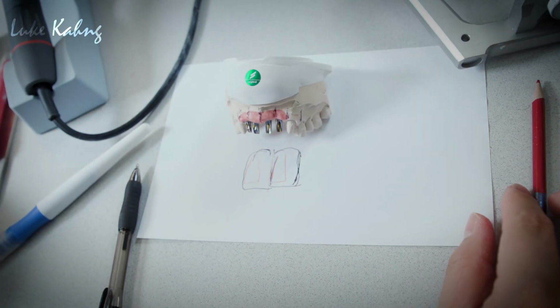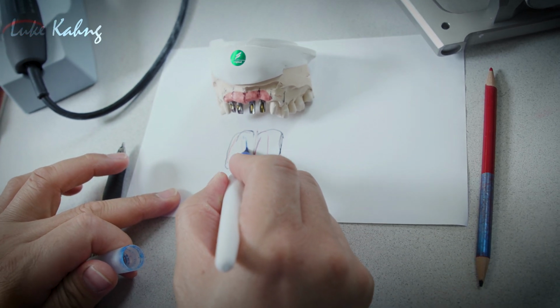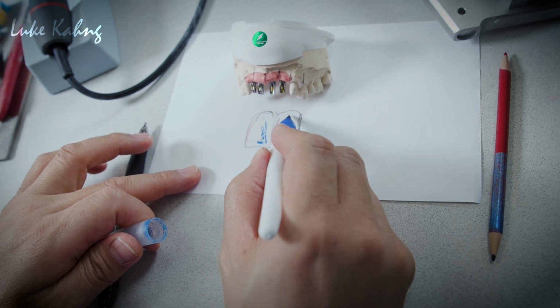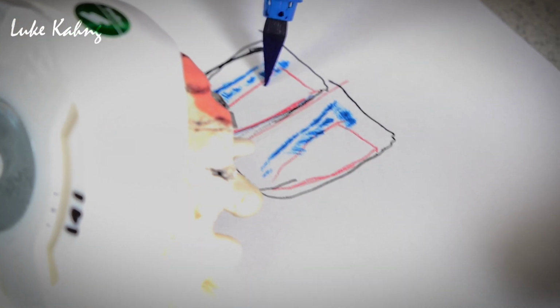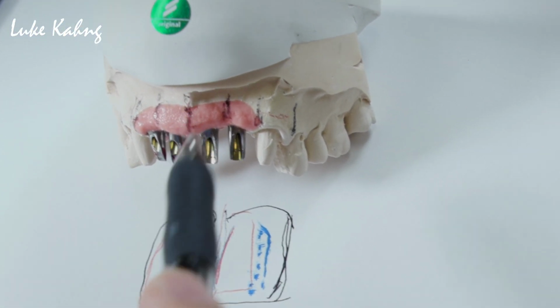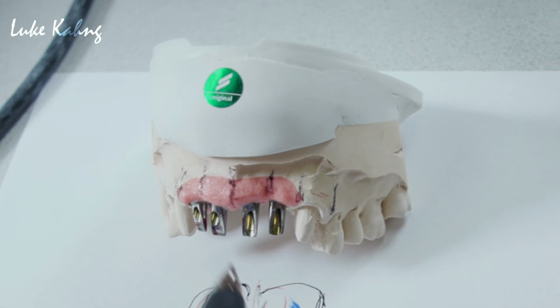So you know, whenever I draw, this abutment is here. Here is more problem. The bigger problem is between here, the technician has to weld it or redesign it. This one I need. This is a good framework. You can take the shot, that was great, makes sense. I'm talking about the framework compared to what I finished finally. What I'm talking about, first the dental laboratory technician made a mistake.